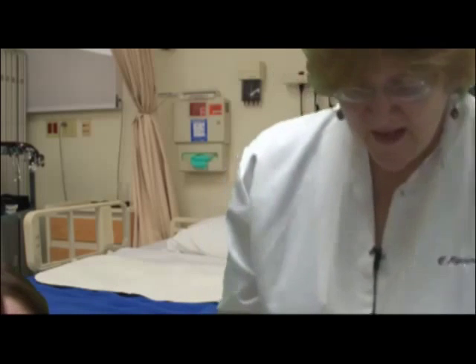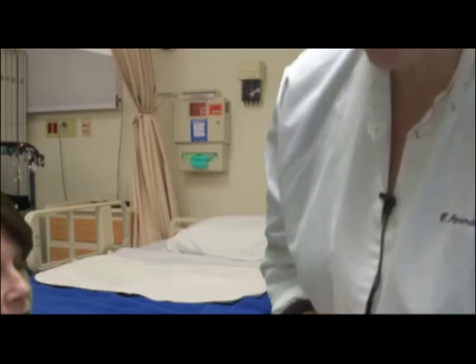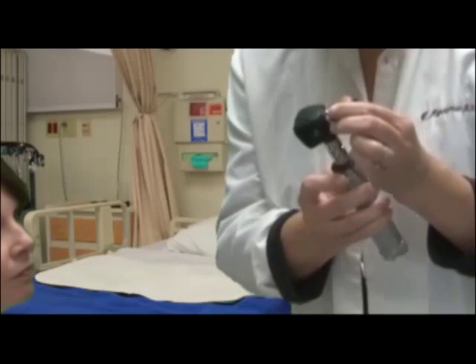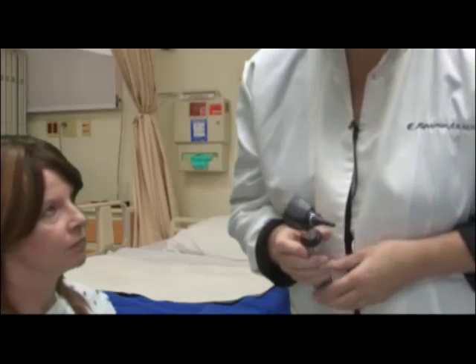Now I would like to do an ear assessment. So I'm going to use the otoscope, and you can also use your pen lights when you're doing the pupillary light reflex. So I've got my scope. This is the otoscope. The ophthalmoscope was needed for the red reflex. Now I'm using the otoscope. I put on a speculum, which are these little black covers, because you don't want to put the scope in a person's ear without a speculum.